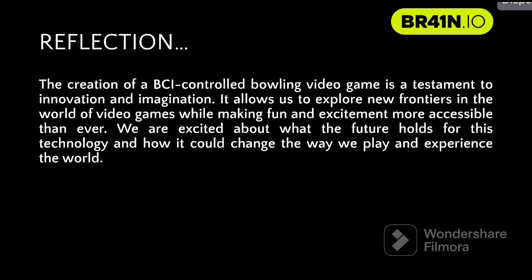The creation of a BCI-controlled bowling video game is a testament to innovation and imagination. It allows us to explore new frontiers in the world of video games while making fun and excitement more accessible than ever. We are excited about what the future holds for this technology and how it could change the way that we play and experience the world.